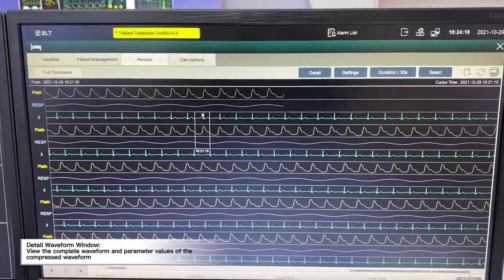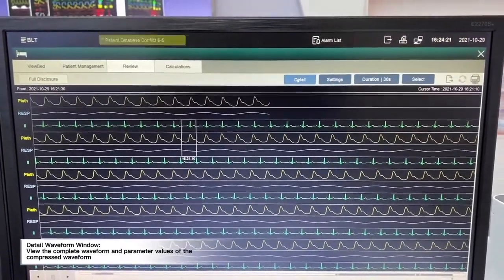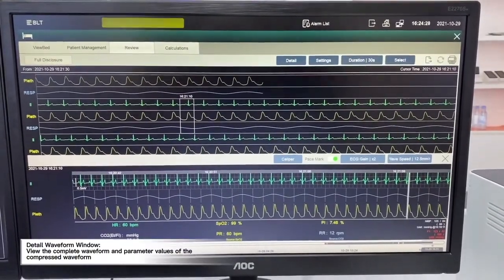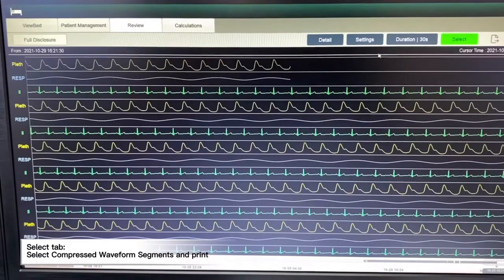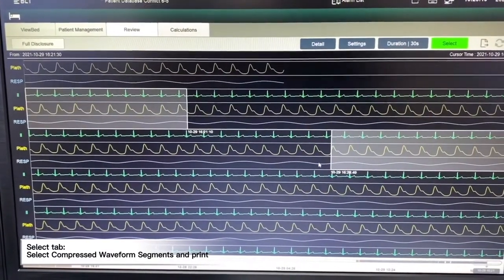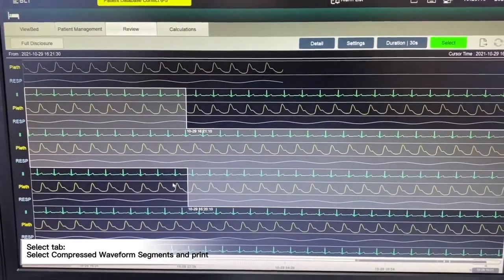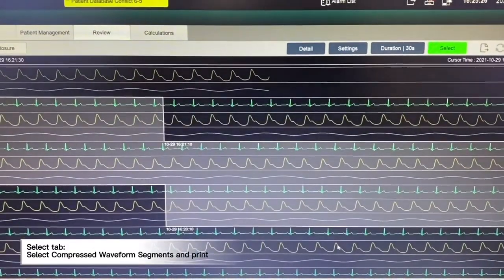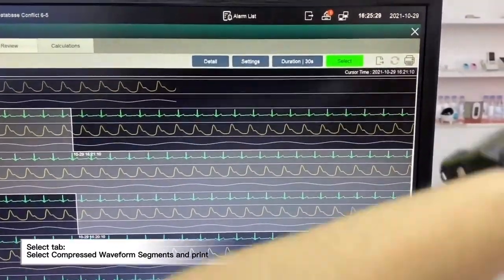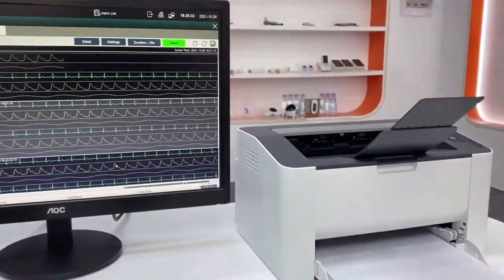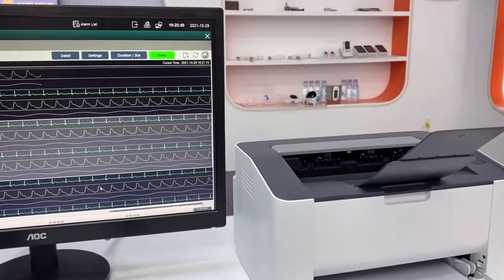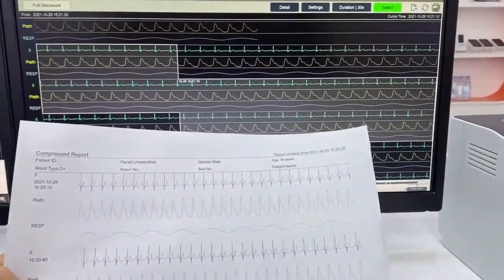If there is an abnormality detected during this period of time and we want to focus on that part of the ECG, we can click detail to open the detailed page for analyzing the ECG. We also have a selection button — once we click it, we will be able to select a period of ECG waveform and print it out. Once we finish the selection, click the print button, and it will print out from the connected printer. As you can see, this is the duration that we selected.